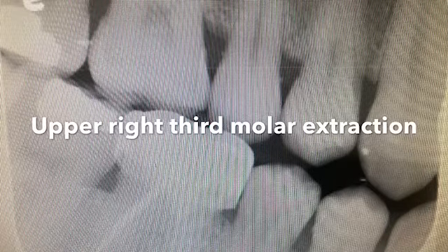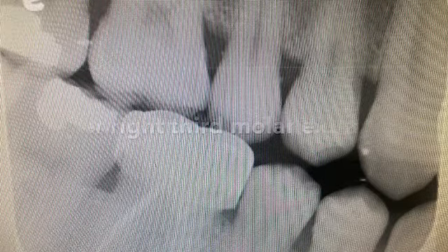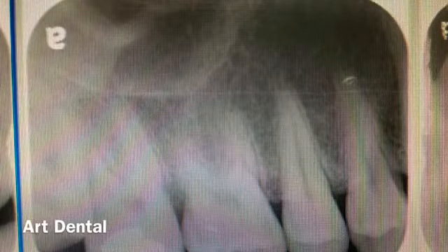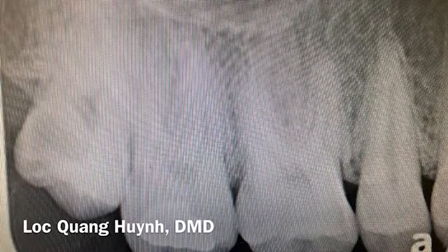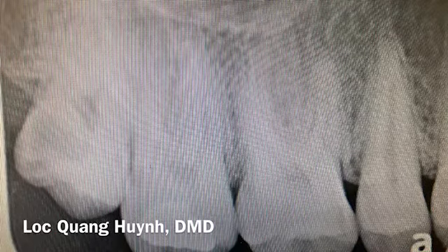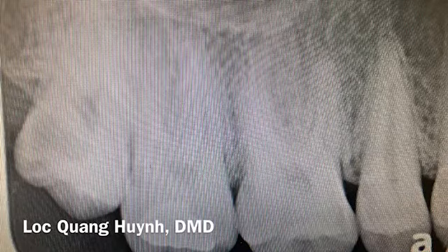But if you look at the PA, you can see the distal radiolucency of tooth number 1. This is the indication that you should look clinically inside the patient's mouth to confirm if there is true caries. In fact, there is caries on the clinical evaluation, on the distal buccal and occlusal part of tooth number 1. So this is the main reason why the patient came in complaining about pain.